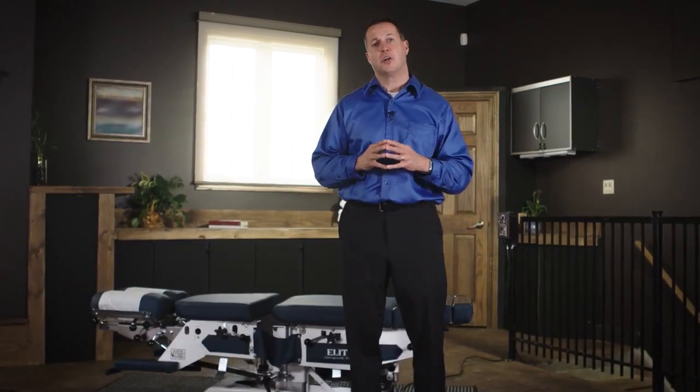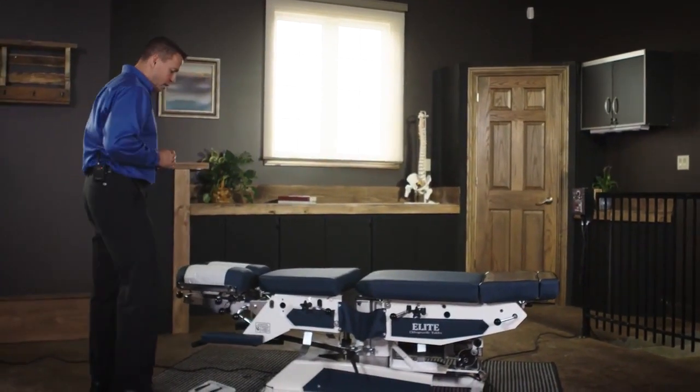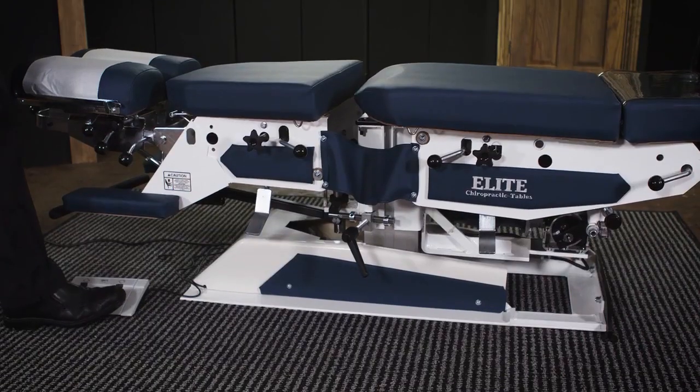This table elevates with electric elevation. It also has three drops. In order to elevate the table, there are two foot pedals — one will raise the table up and the other one will bring the table down.